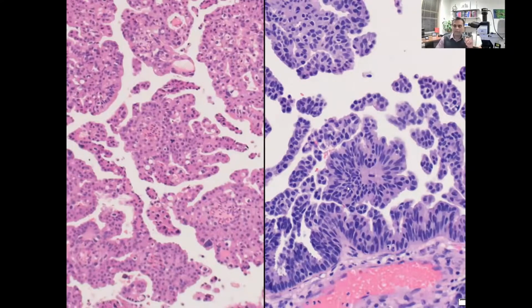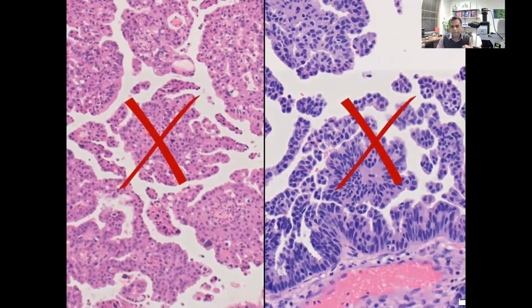In this situation, and also in this particular situation, where you can actually see the surface urothelium, and from the surface urothelium, you see this in situ component of high-grade carcinoma that's growing as micropapillary structures, right? So no invasion again. In both these situations, studies have shown that this does not have the same prognostic impact as invasive micropapillary carcinoma, and one should not use that terminology.